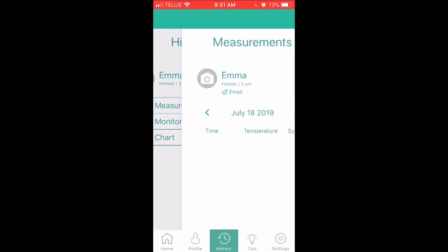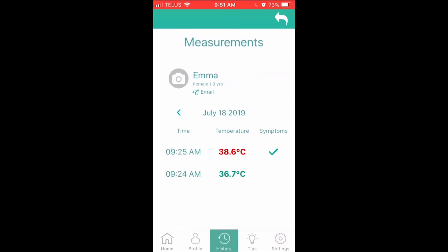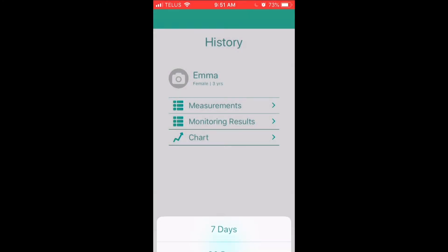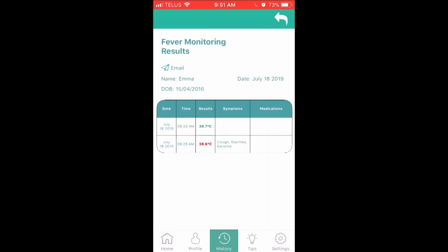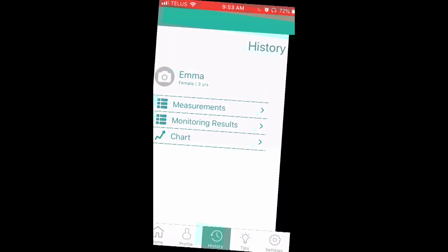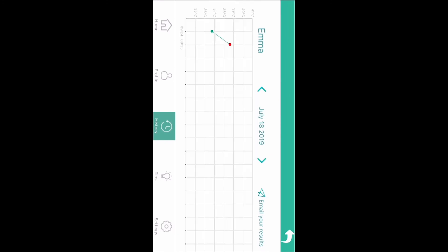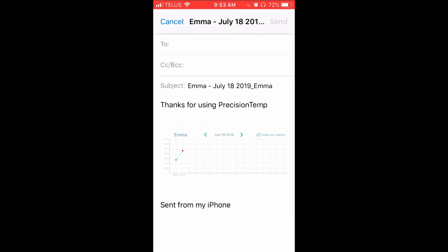In this section, you can see charts and graphs to monitor the progression of a fever. In the measurement screen, you will see a list of readings, newest to oldest, for the chosen day. To see previous days, press the back arrow on the screen. In the monitoring results screen, you have the option of seeing the last seven or 30 days of readings. Finally, in the chart screen, you can view daily results. From all three screens, you can email the results to your family doctor. To email, simply tap on the word "email" and the email program on your device will appear. In the body of the email is the selected information you want to provide.